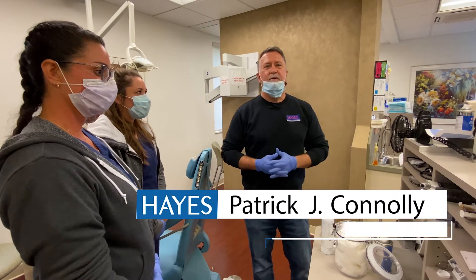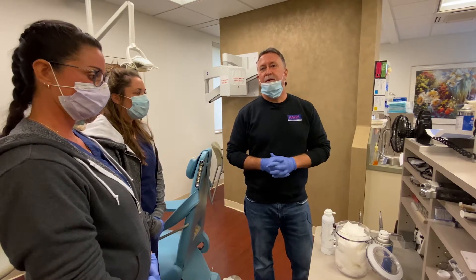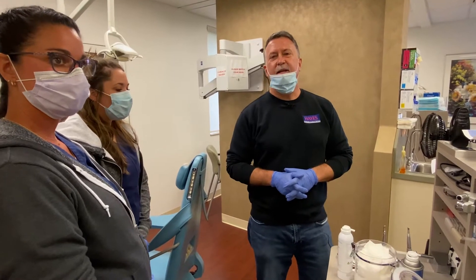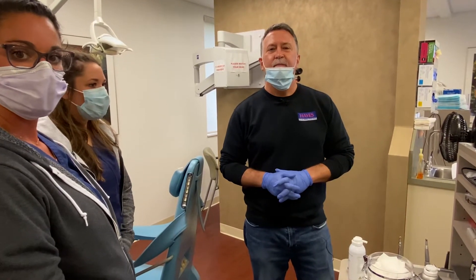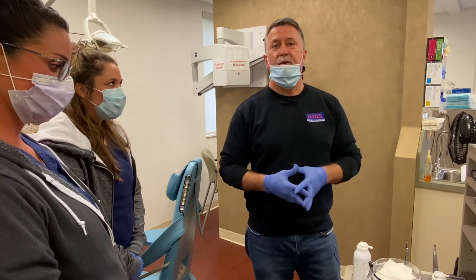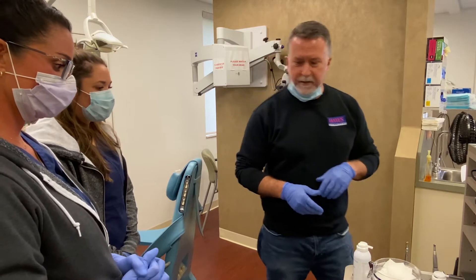Good morning. I'm Patrick Conley with Hayes Handpiece Repair Company and I'm here with Don and Jenna this morning. We're going to talk about high-speed and low-speed handpiece maintenance and repair. We'll start with the high speeds because that's probably one of the most critical aspects of the maintenance process.